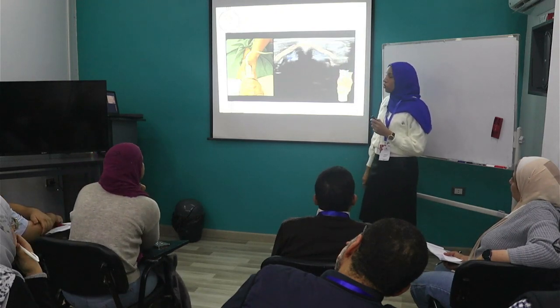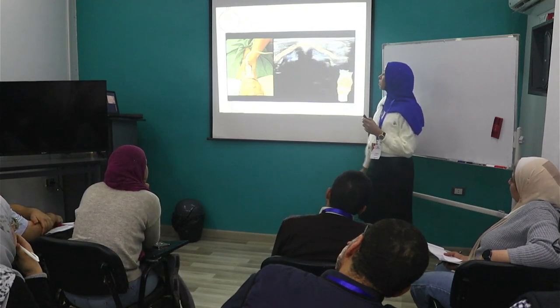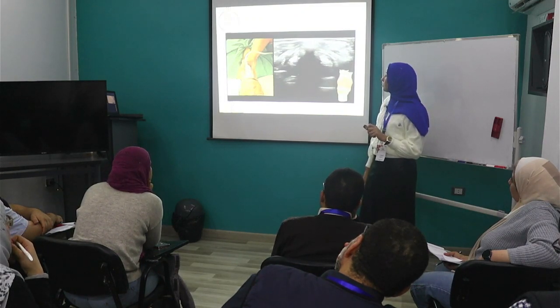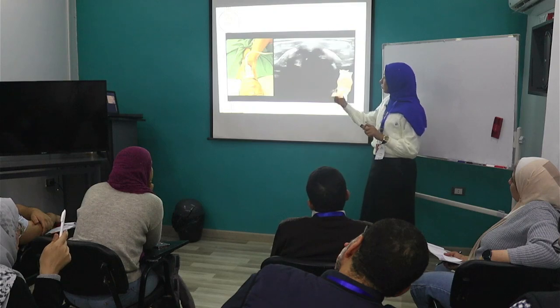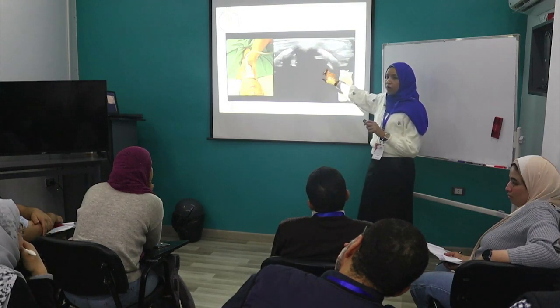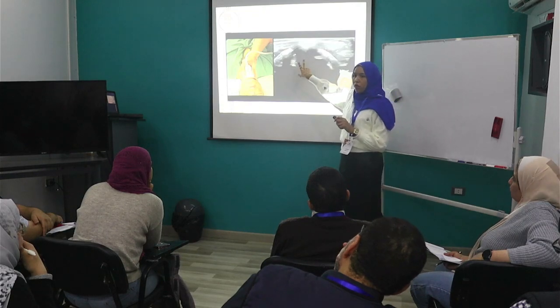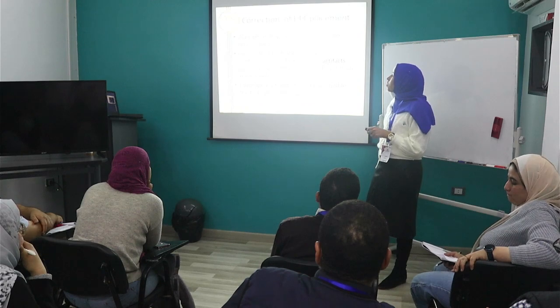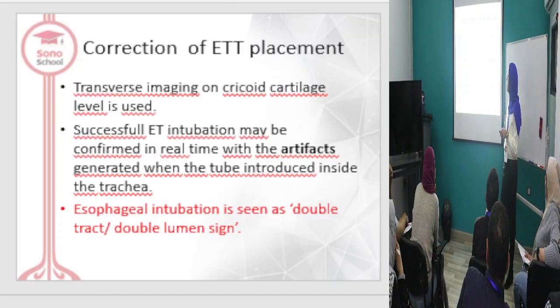Thyroid cartilage, vocal cords. The movement when he was speaking moves the vocal cords, moving vocal cords. Confirmation of endotracheal tube placement by transverse imaging at the level of the cricoid cartilage. Successful endotracheal intubation is confirmed by the presence of artifact.